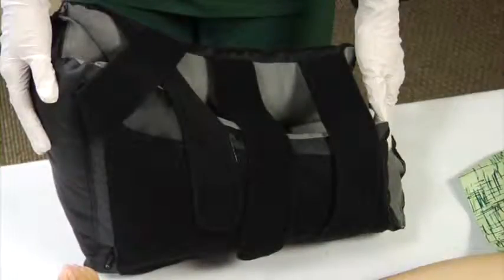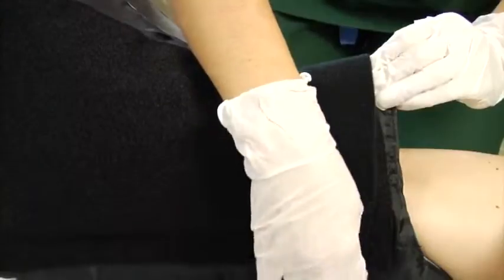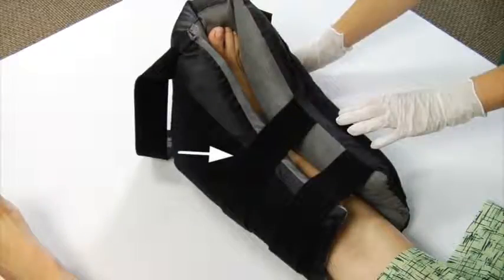The 4 heelmedix straps use a hook and loop fastening system with a large landing panel on the side of the boot to accommodate most any size foot and leg comfortably. They don't have to be pulled tight to be effective. Start with the 2 straps farthest from the foot. Beginning with the farthest strap, cross them straight over the leg and secure to the other side. The straps should be roughly parallel. They can be snug, but not tight.